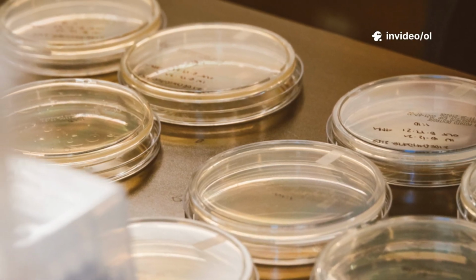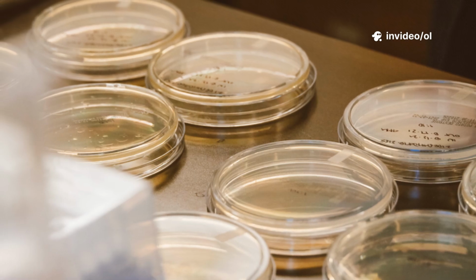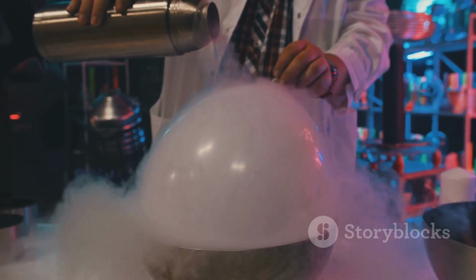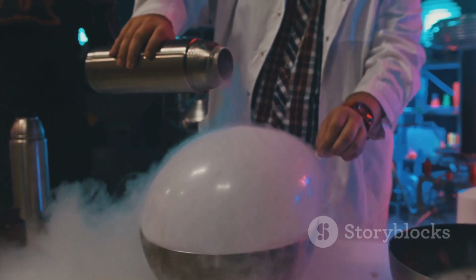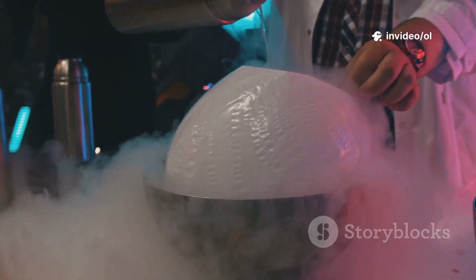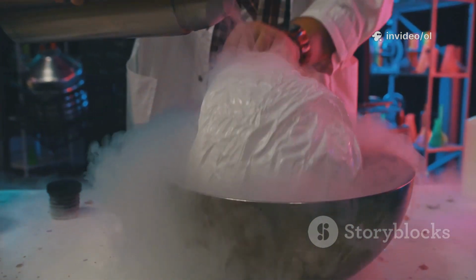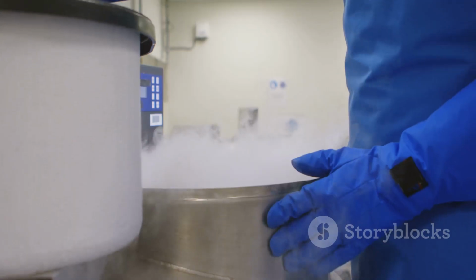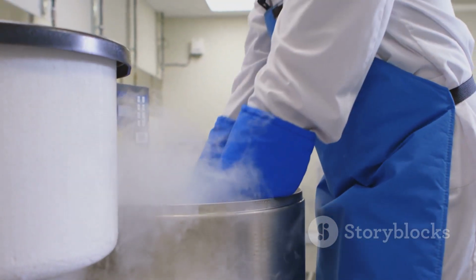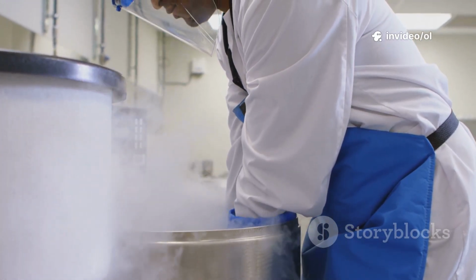Sometimes the sperm retrieval is done before the egg retrieval. In other cases, extra sperm may be found. When this happens, the lab can freeze the sperm for future use. This process is called cryopreservation. The sperm are placed in a special solution that protects them and then frozen in liquid nitrogen. This provides a backup so you may not need another retrieval. Frozen sperm can be thawed later and used for ICSI with very good success rates. The lab's work is the vital link between the retrieval and the creation of an embryo.